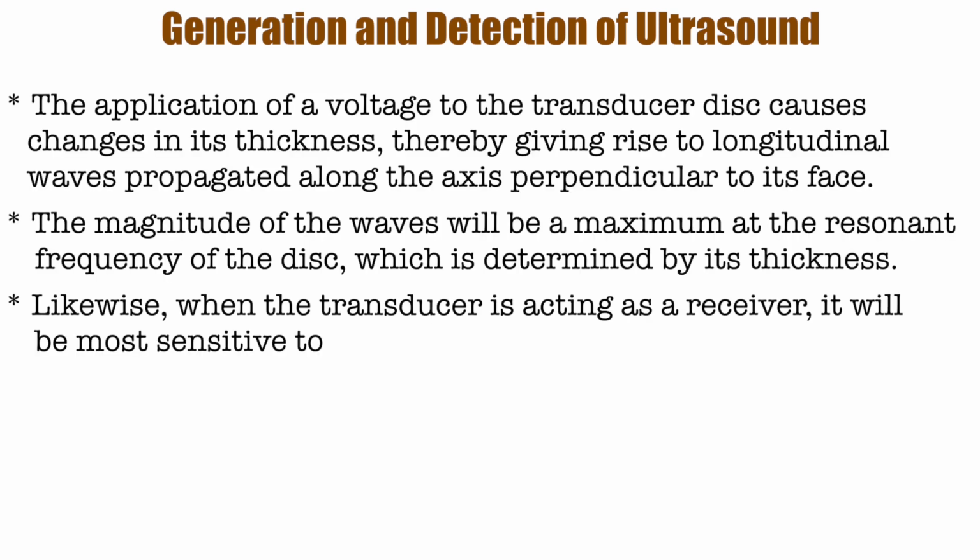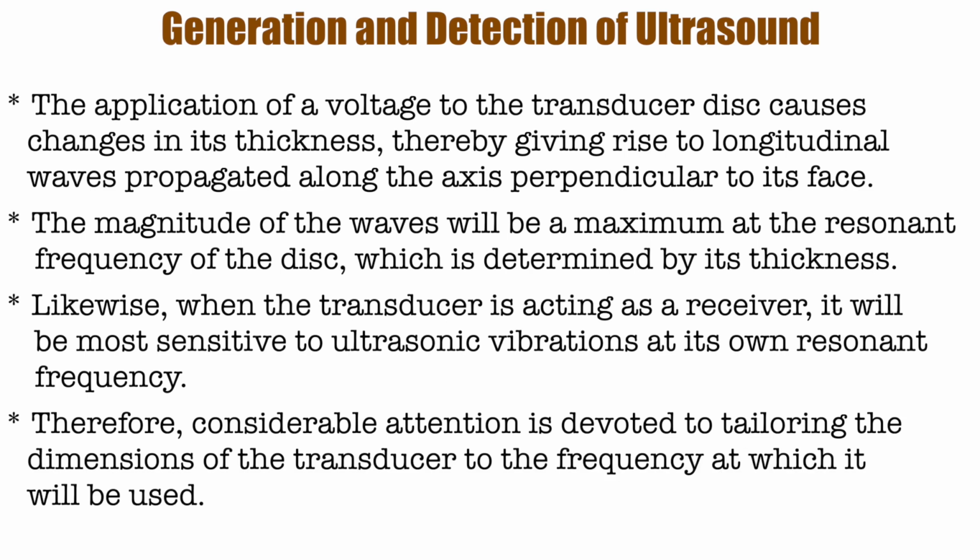The application of a voltage to the transducer disc causes changes in its thickness, thereby giving rise to longitudinal waves propagated along the axis perpendicular to its face. The magnitude of the waves will be a maximum at the resonant frequency of the disc, which is determined by its thickness.